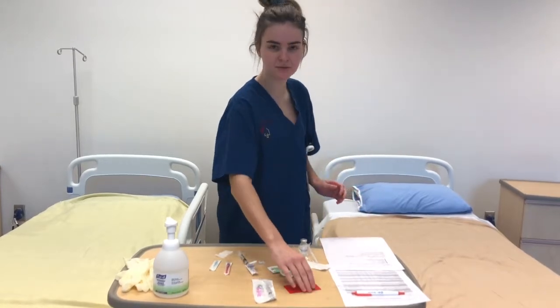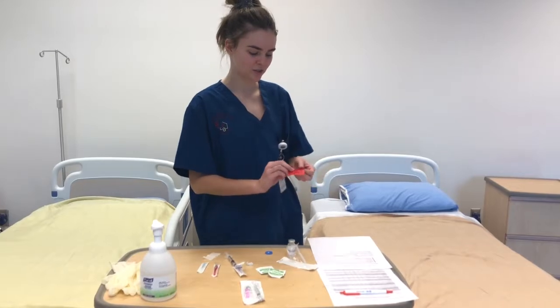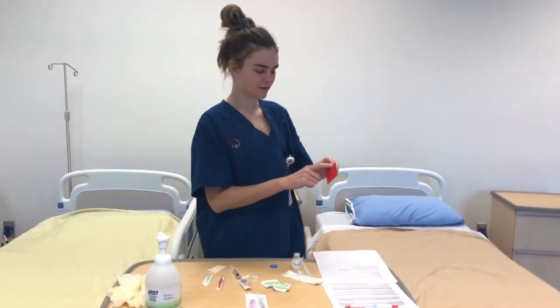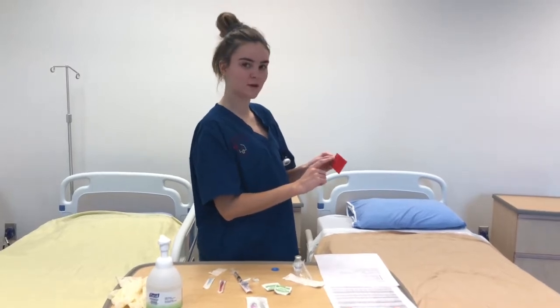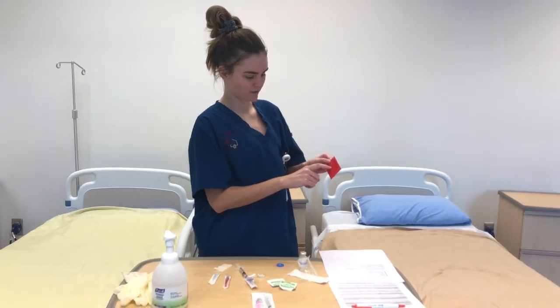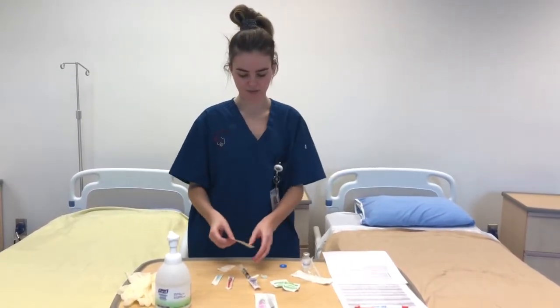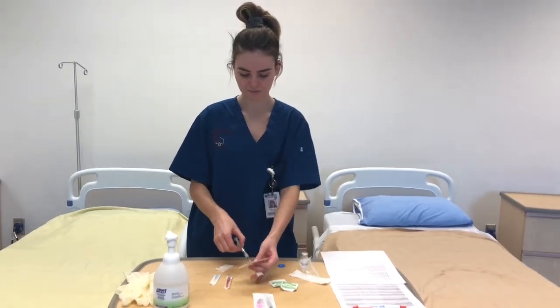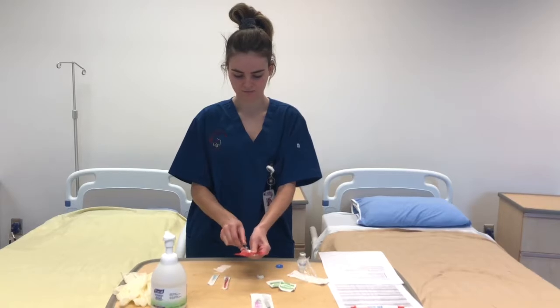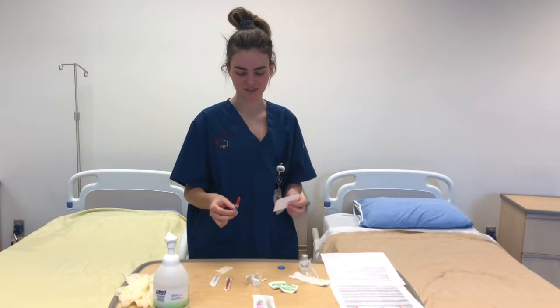And now that it's recapped, and since we're doing 2 injections into Mr. Mancini, it is good to use a medication label. And so on here, I would write the patient, Mr. Mancini, his room number, the drug, which is heparin, the amount, which is 1 milliliter, and the flow rate and the start time and the date, and then I would stick it to the syringe so that it would be properly labeled.